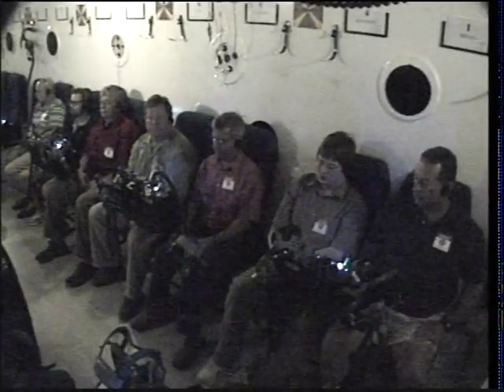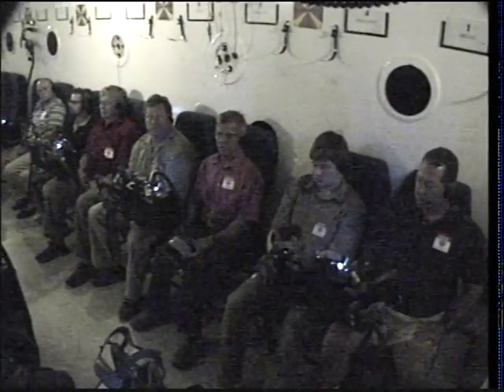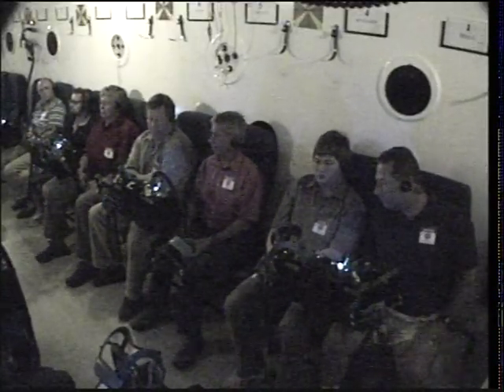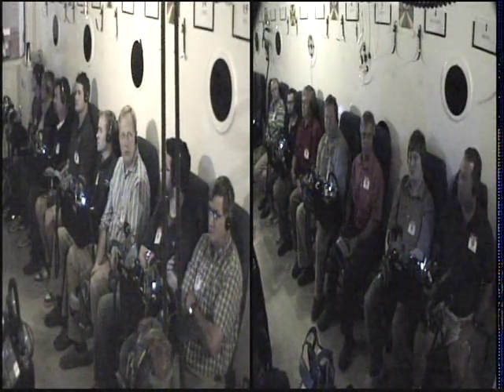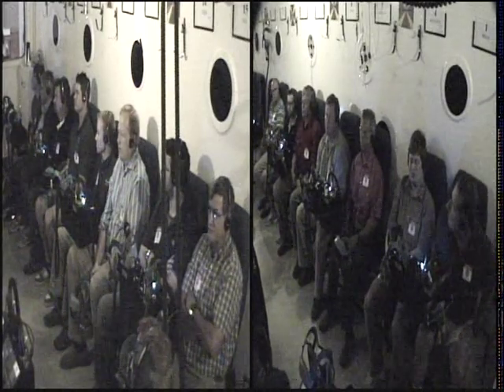Now, full dark adaptation actually is going to take more like 35 to 45 minutes, somewhere in that range. But within the 5 minutes that we're off, there's going to be a significant amount of dark adaptation that takes place that gives us the impression that our vision is getting better. As the lights come up, we can see further down the chamber. Our vision appears to be getting better. But what you don't notice right now is the effects of that low-grade hypoxia on your visual acuity. And that's what we're going to demonstrate here in just a moment.